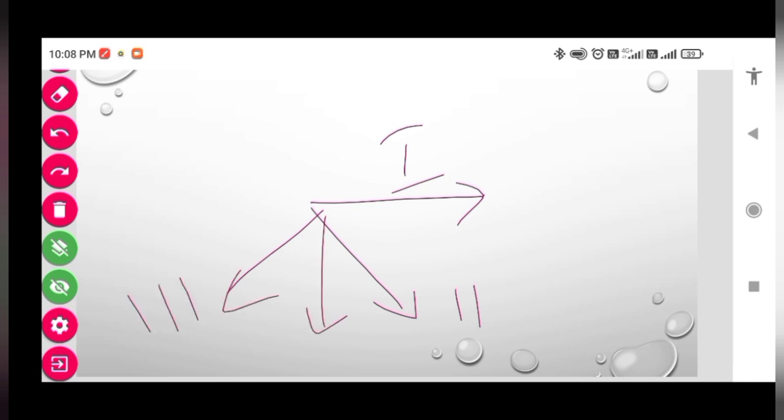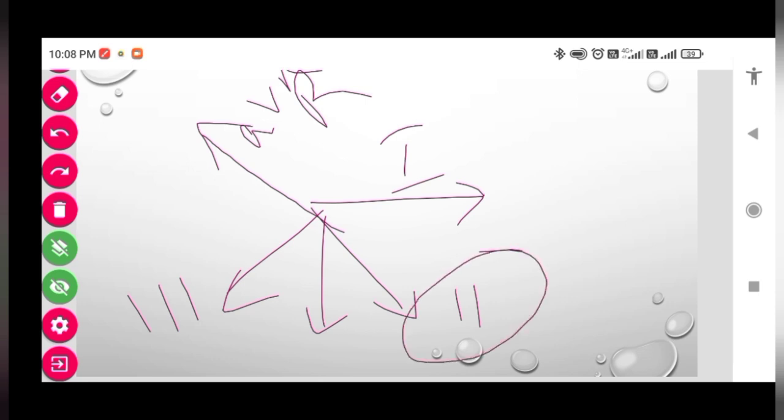So there is one more augmented lead that is exactly opposite to lead 2. What is that? AVR. So the waves which you are seeing on lead 2 are exactly opposite to those on lead AVR.